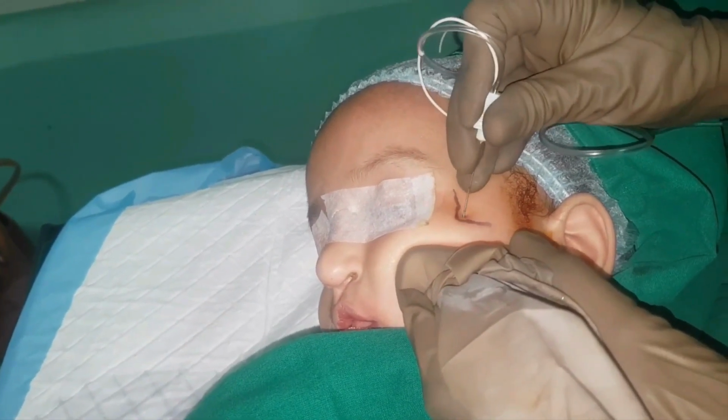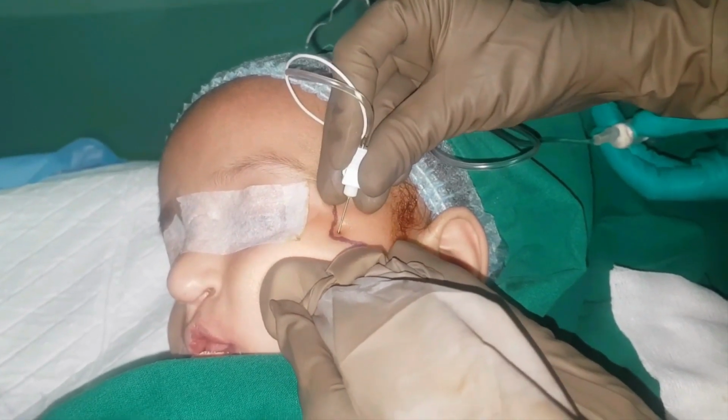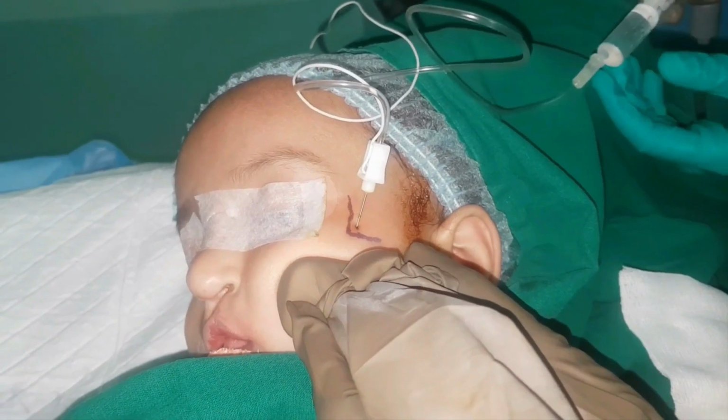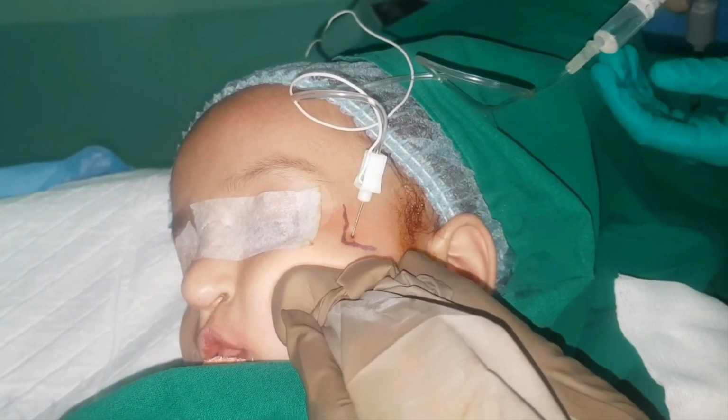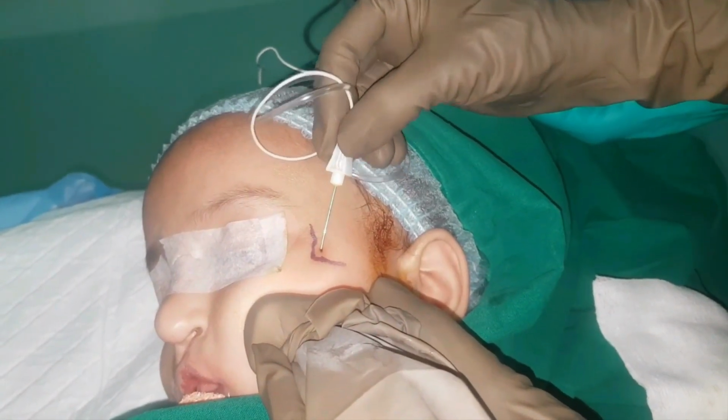Note the probe position. Once the needle tip is inside the fossa, 0.2 ml per kilogram of 0.25% ropivacaine or bupivacaine is injected after ensuring a negative aspiration and is injected in aliquots.